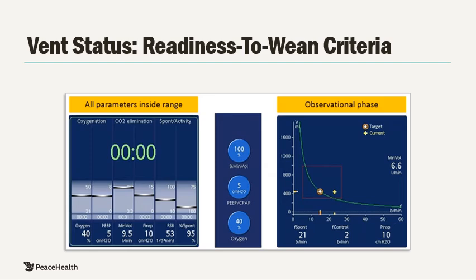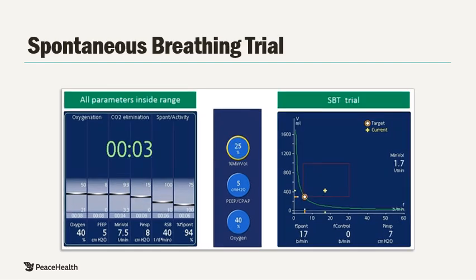We can now see that the patient has met all 6 parameters successfully, engaging all 6 clocks, so that we now have a green master clock counting in minutes for as long as the patient continues to meet all 6 criteria. We now see that the same patient has met all criteria for a total now of 3 minutes.